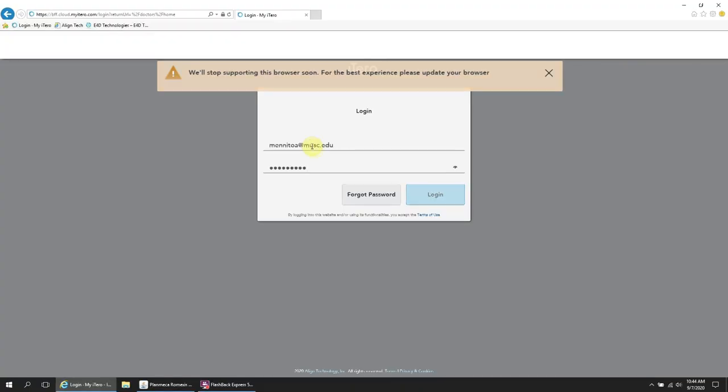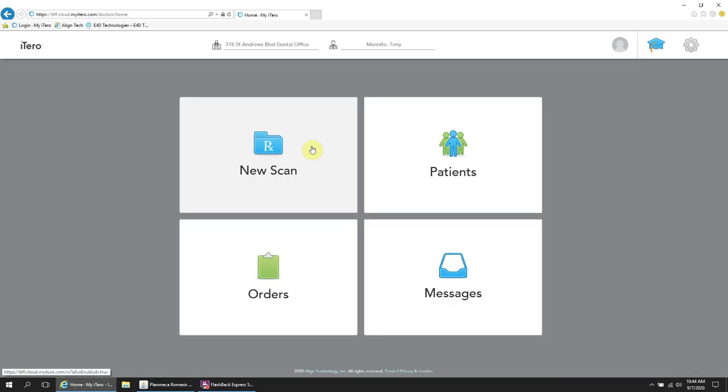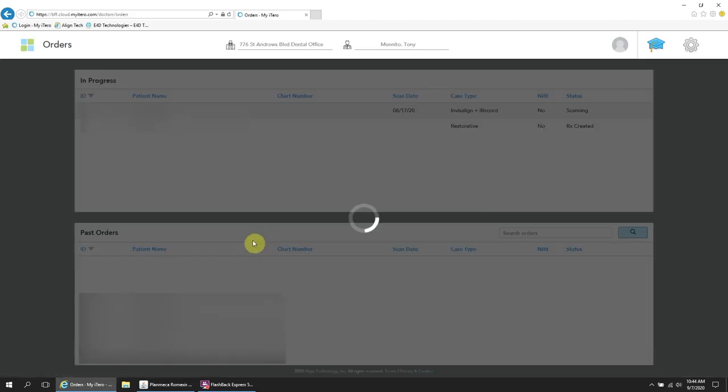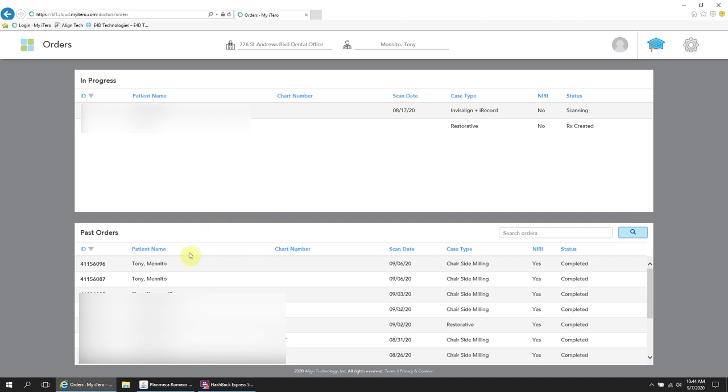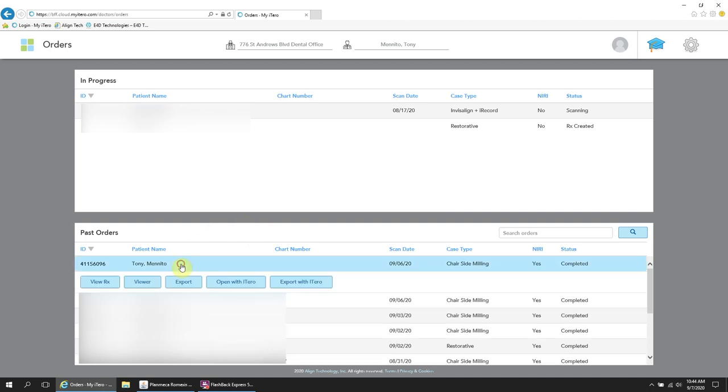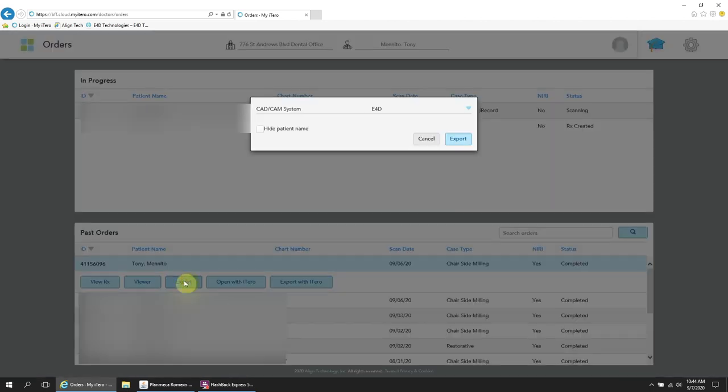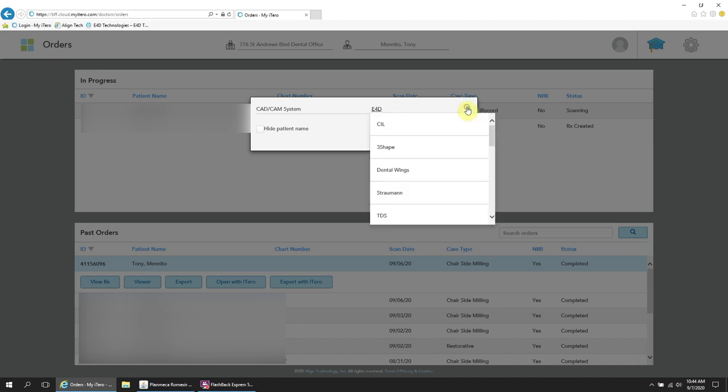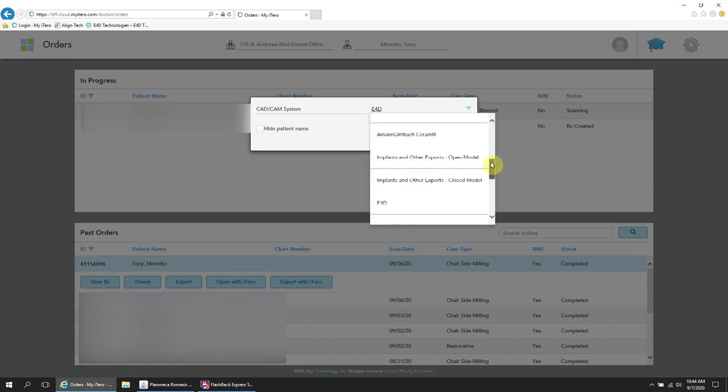You will log on to the iTero portal on this website first because we need to get the STLs. And this is very simple. You basically just pull up the case and you hit Export. And you see how it's labeled as E4D up there? That is the setting.